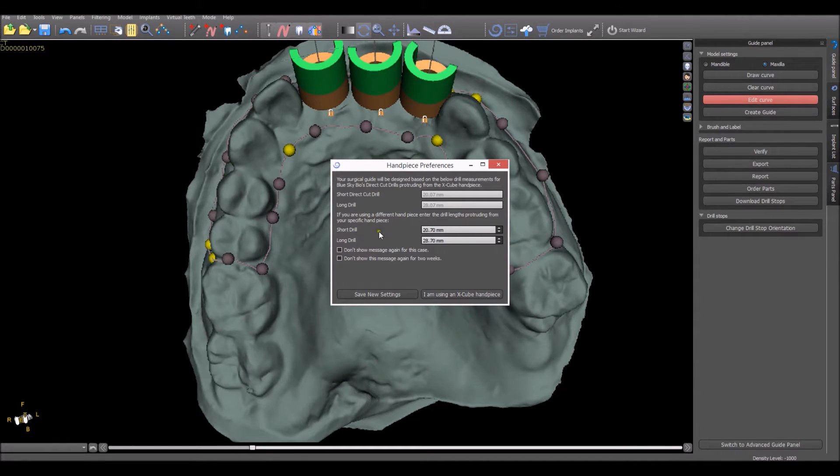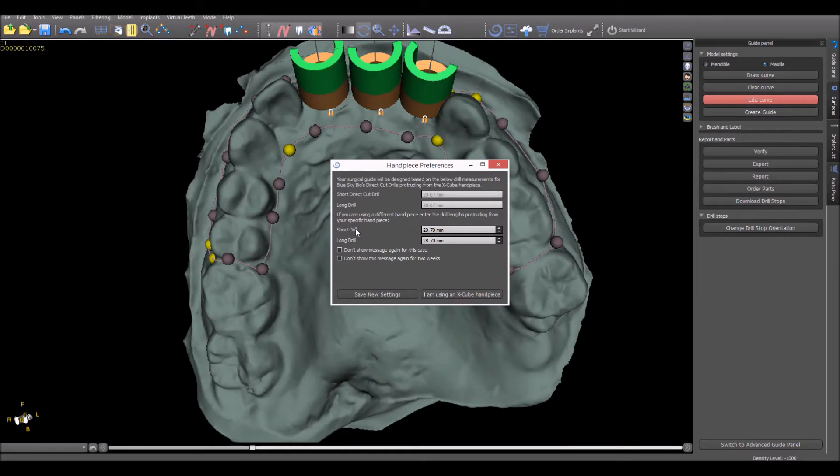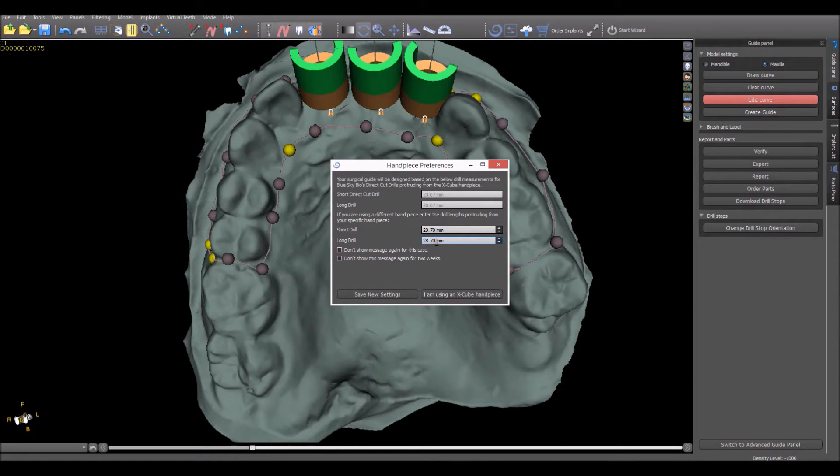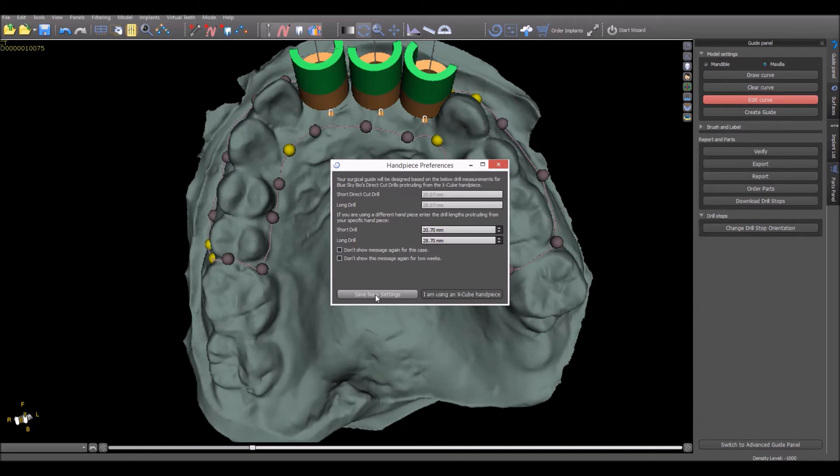If the user is not using the X-Cube handpiece, the drill length can be changed by measuring the length of the drill extending from your handpiece and entering them into the fields on the screen. Once the measurements have been changed, you can click Save New Settings and these will be saved as your global default drill lengths for the built-in drill stops for future cases.